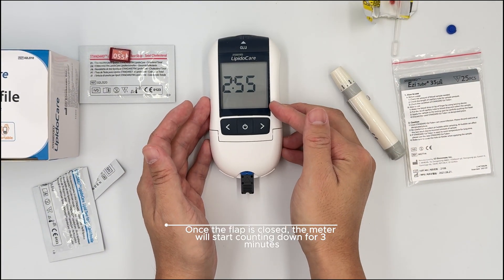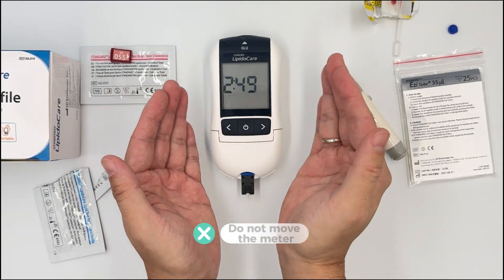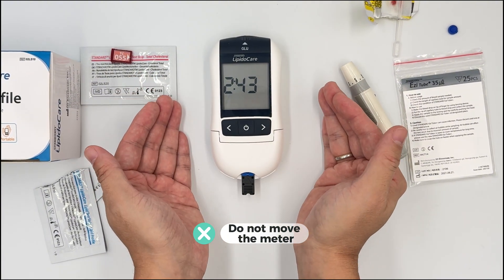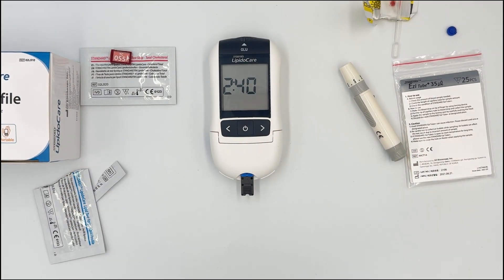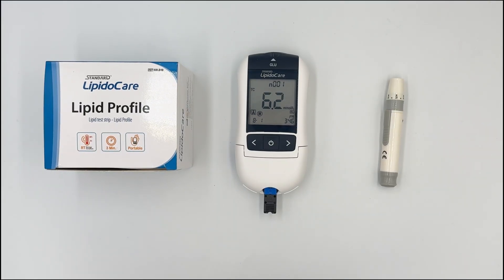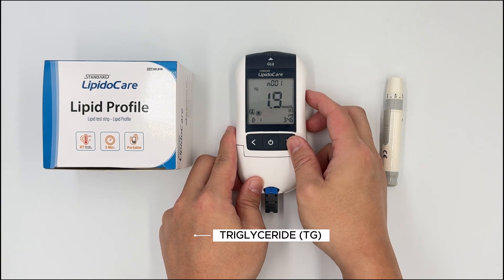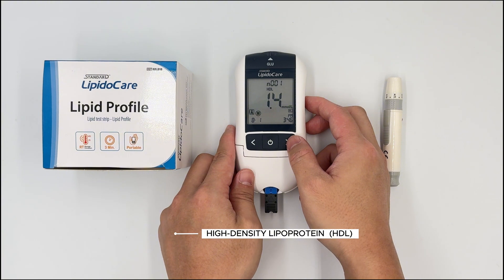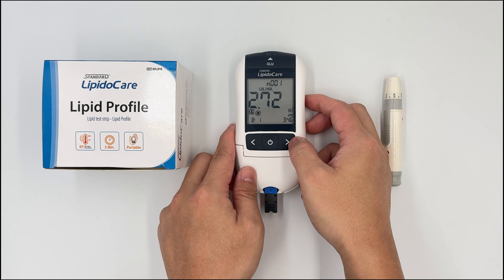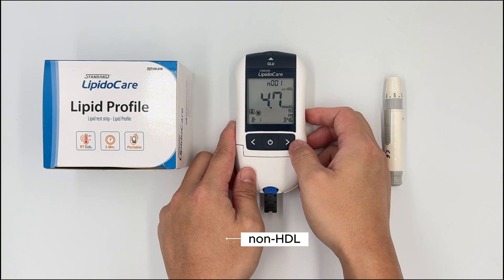The timer will start for three minutes — just wait for the result. During the test, do not move the test strip because the system is working inside to detect your cholesterol level. Once your result is out, you'll see the TC sign blinking for total cholesterol. Click next for triglycerides, then HDL, then LDL, then the LDL over HDL ratio, and finally the non-HDL. That's how you use the Lipid Care.